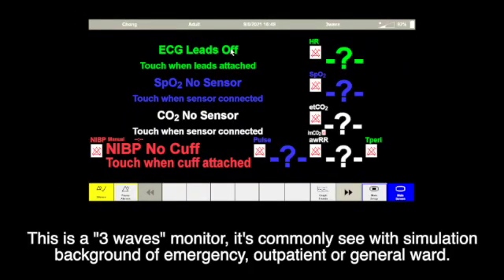This is a three waves monitor. It's commonly seen in simulations with a background of emergency, outpatients, or general ward.